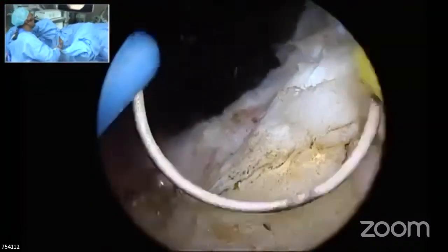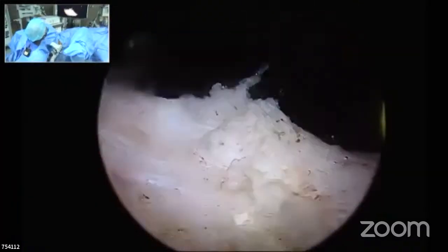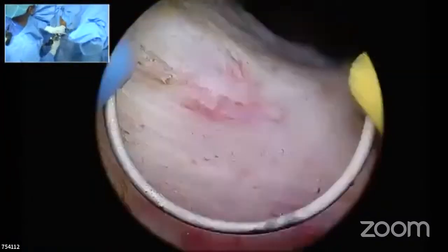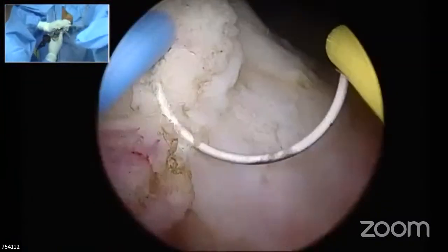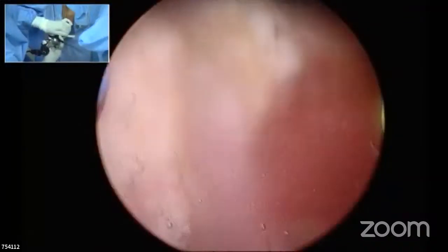Looking at the roof, which is not going to be bleeding, and looking at the 11 o'clock area, this is the area where we coagulated the artery here, and looking at the rest of the things. Are there any small tissues which are left behind? You resect it off. And don't go for it.